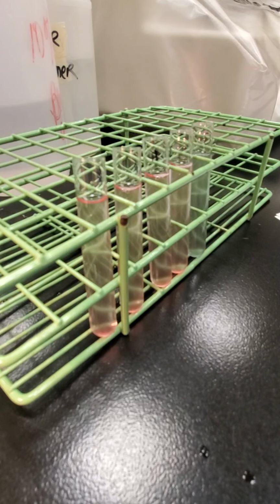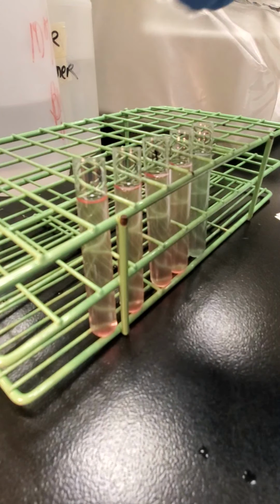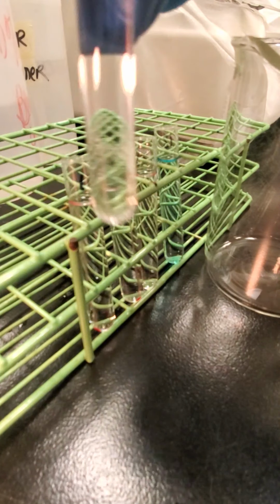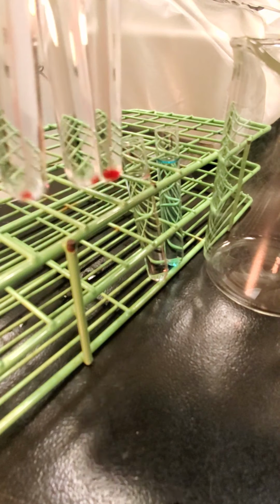Okay, so then I'm going to put these tubes in a spin for 1 minute. So I'm going to pause the video. Okay, so I've just taken my tubes out of my centrifuge. They've spun for a minute. So I just want to show you, all the red cells are down at the bottom of the tubes. So I'm going to dump these and take off the saline.